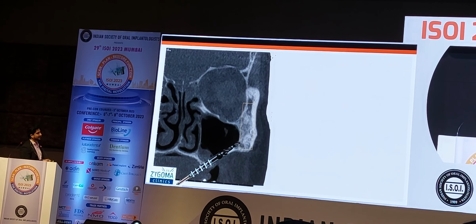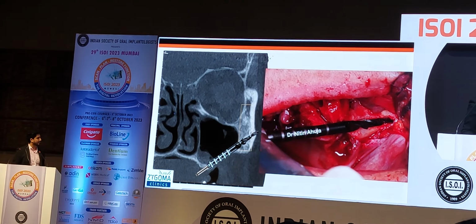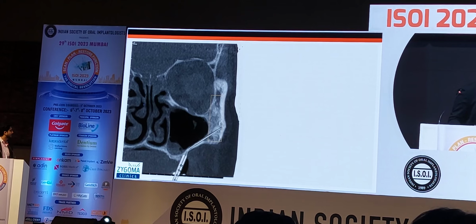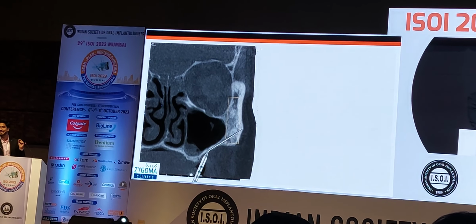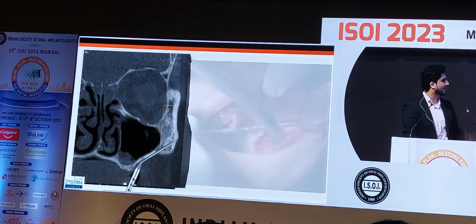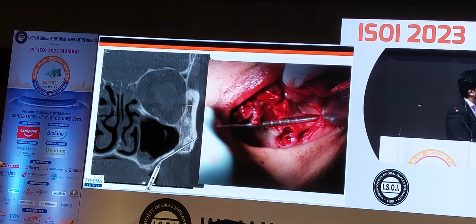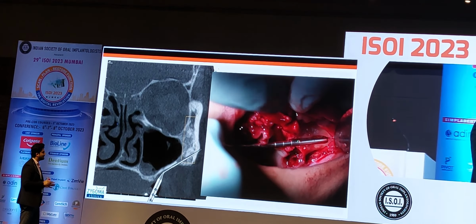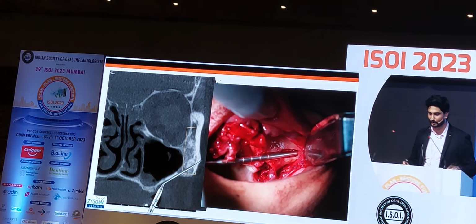So this is the drill, the diameter is 4.2 mm. Okay, you go into the osteotomy, you go and prepare an osteotomy into the zygomatic bone. Then this is, for me, the most important step: to choose the right length of zygoma. So how to choose it? You first take it out of the bone and then give a palatal pressure and just see that it is always ending up in this region. So second ring, which means I have to open a 40 mm zygoma. See, every time when I am trying to pull, it is ending up here. So 40 mm, 37 mm, any zygoma I can place.